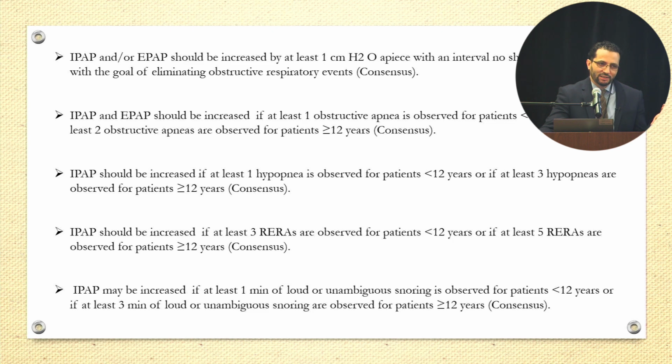We go beyond that range in other cases, like chronic hypercapnic respiratory failure. But for patients who are just having apneas and hypopneas, you increase the EPAP for obstructive apneas, but you have to increase them both. For hypopneas, you increase your IPAP, but you have the limit of the pressure difference of 10. So if you get to 10, then you have to increase your EPAP with that.